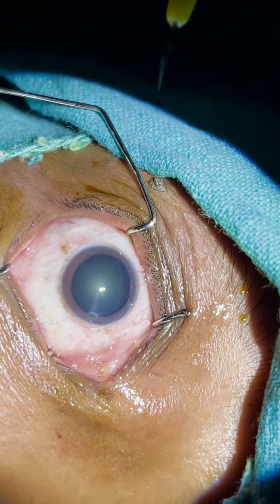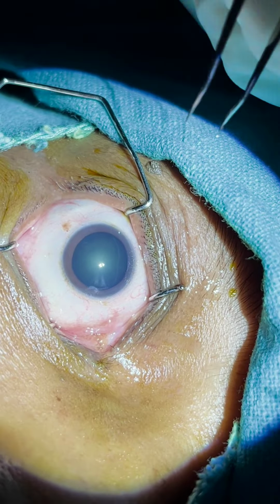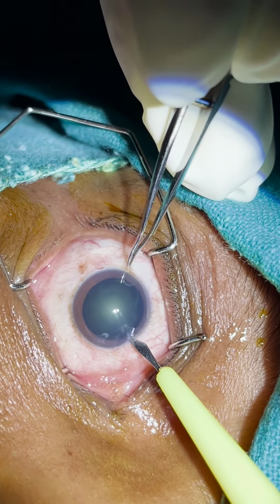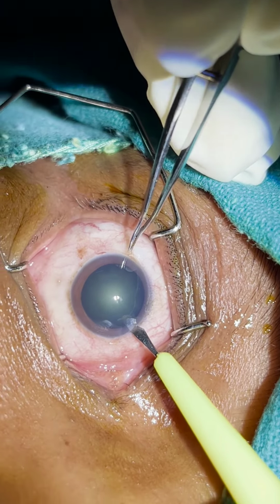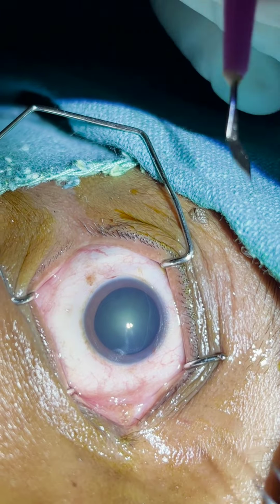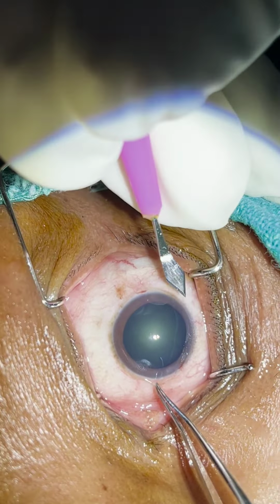I proceed with my first side port, and here is the second one. Usually the first side port is at 45 degrees and the second one is at 90 degrees from the main incision. Now I am giving a limbal incision.